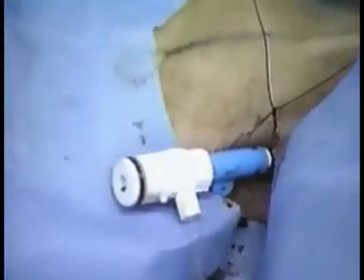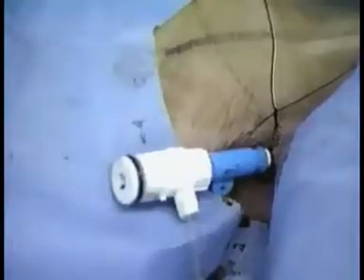Place several knots in the anchor. Loop the suture around the catheter several times and then secure with several additional knots.